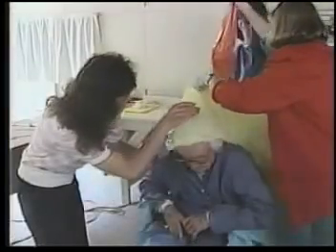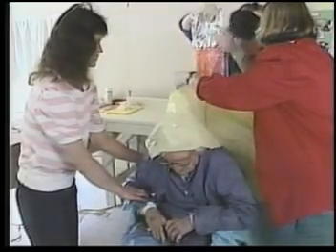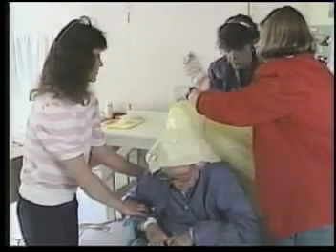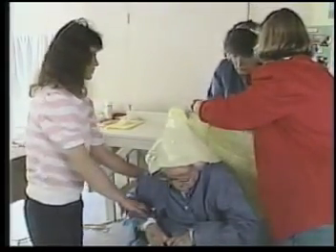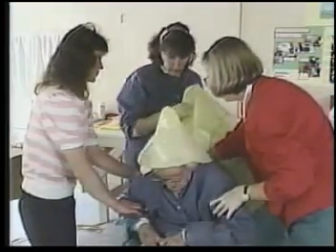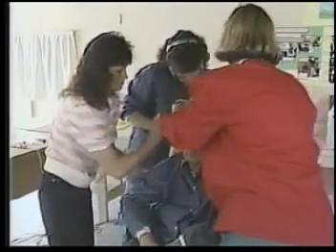To pour the back insert, lean the client forward. Remove the lock at the bag opening and firmly grasp the neck of the bag. Carefully place the bag, neck first, deeply into the molding bag between the client and the base foam. Pour the liquid from side to side. Carefully remove the emptied bag pack from the molding bag and dispose of it in a trash container.